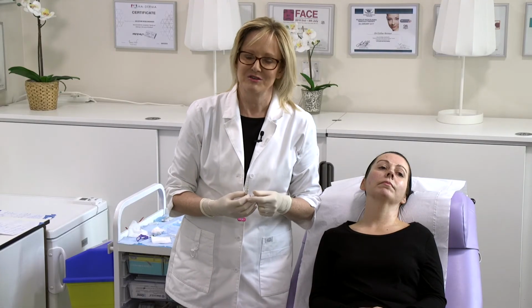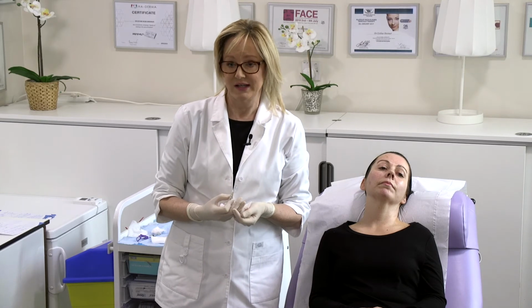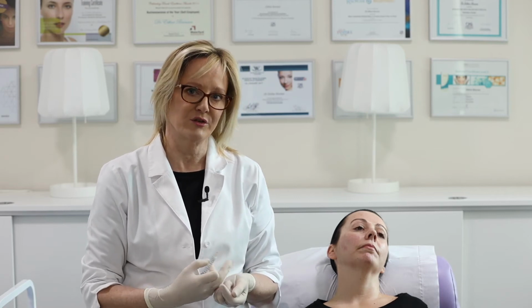I'm happy with the results already. We've improved that look of sadness and tiredness. We've indirectly improved the tear trough. We've helped lift her oral commissure, which was a little more downturned on the right. We've expanded the SMAS and given her some nice volume and some contour and lift.